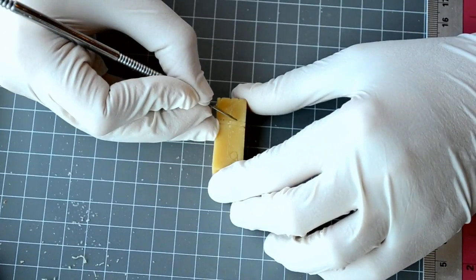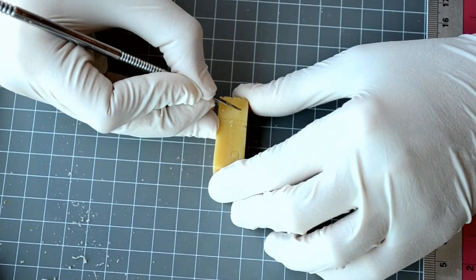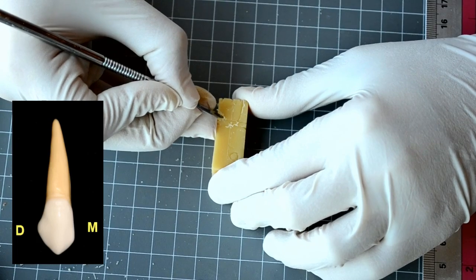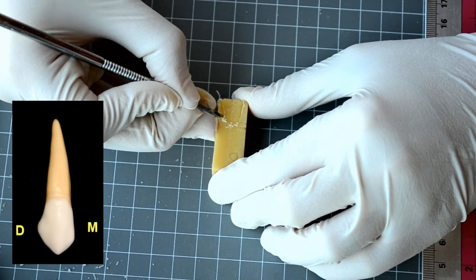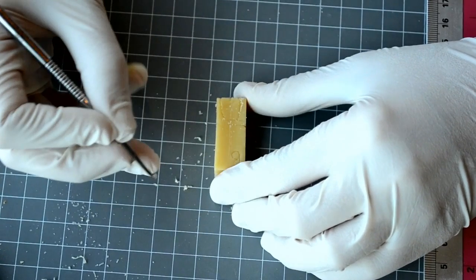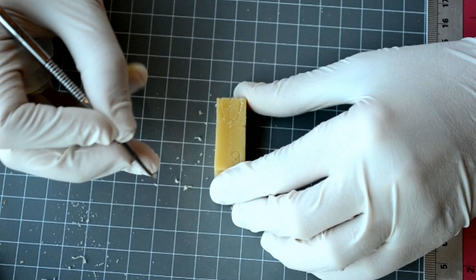After you set your measurements, use your Lecron carver to draw the outline of the tooth, keeping in mind that the mesial outline of the canine is straight, while the distal outline is more convex. Remember that the crest of curvature is located mesially on the incisal third and distally on the middle third.